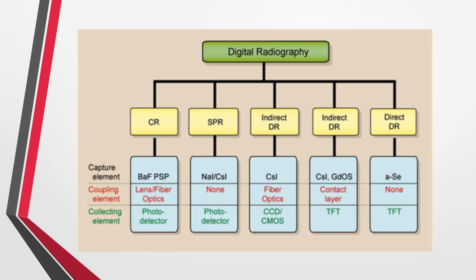This is another look at digital radiography. CR is considered digital radiography because it is a digital signal. It's not an analog signal like film is. So it's here, and this is that.